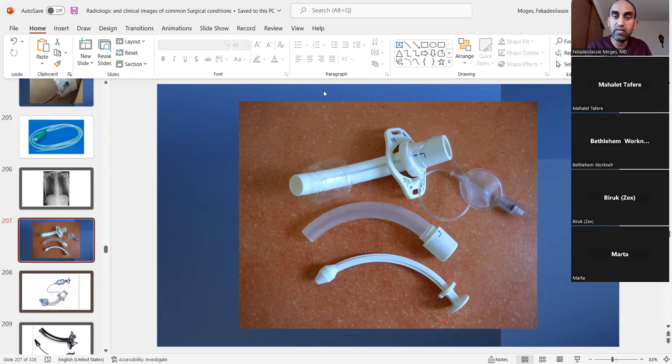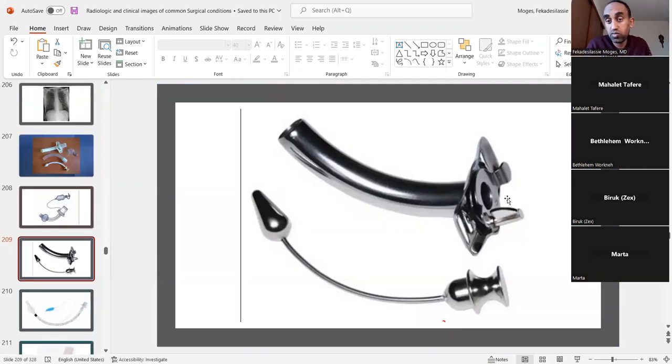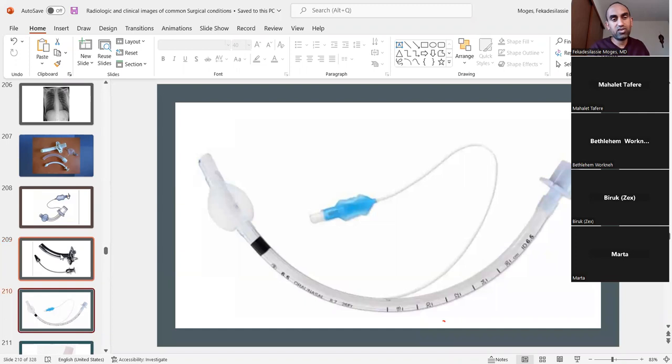So the metallic tube, the advantage is that one. Why the metallic tube? The same reason, it's just because it has an inner tube. The inner tube is this one, you can take it out. They have assembled it, that's why you can't see it, but you can see something here, right? That's what you pull. And you see this part here? This part is a lock. You rotate it, it locks, you rotate it, it opens, then you can take it out. So the patient knows, the attendant knows, when it gets clogged, they will take it out, wash it, put it back, okay? All right. I think I said enough about tracheostomy.